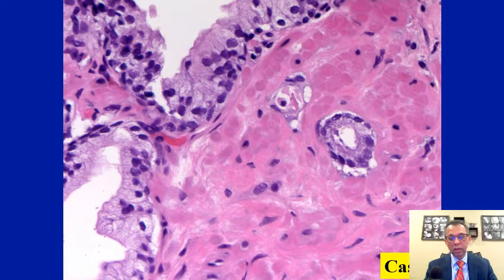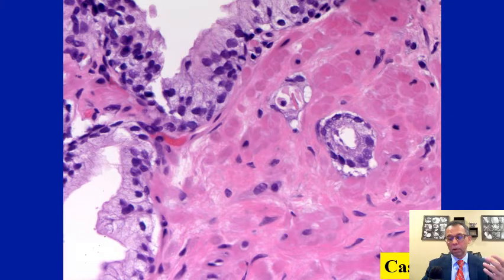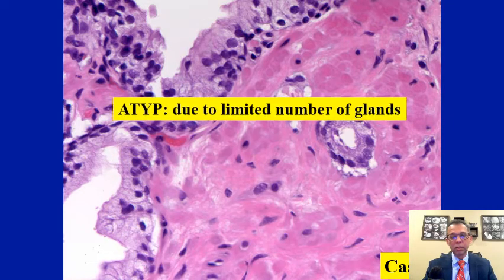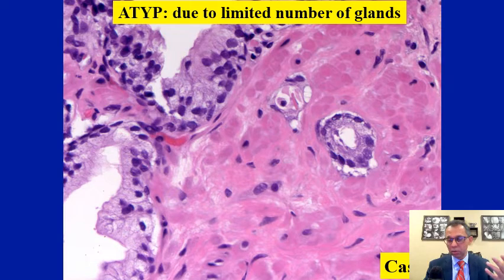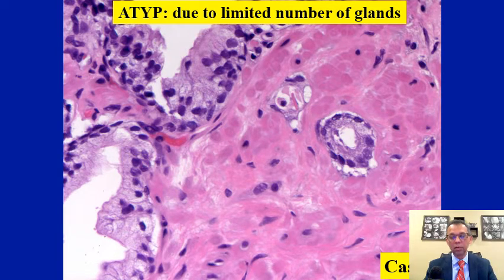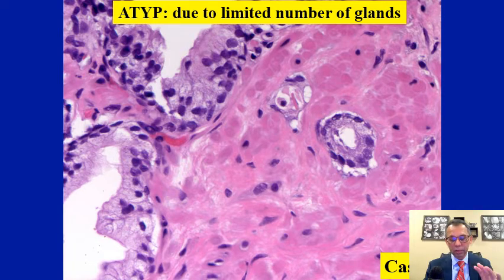Let us review case 1, which shows two cytologically atypical glands. These glands are clearly atypical but quantitatively not enough to call cancer. This is a result of atypia due to a limited number of glands. Most urologic pathologists typically require three or more glands to make a definitive cancer diagnosis. There is no magic number — it also depends on the overall architectural and cytological features present within the lesion. But in general, you would like to have at least three glands to make a comfortable cancer diagnosis if the lesion otherwise shows good major features of cancer.